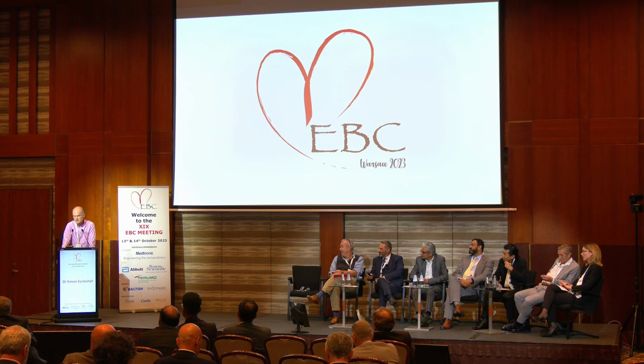Otherwise anything that is done is anecdotal. That's what all the RCTs are showing you currently: there is no difference in restenosis rate in de novo work between stenting and DCBs. You don't have any randomized clinical trial on left main on that.